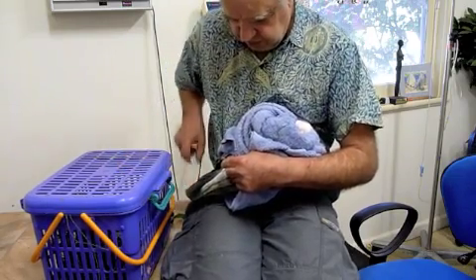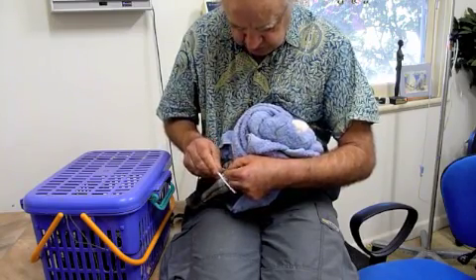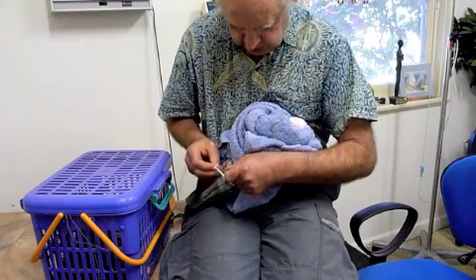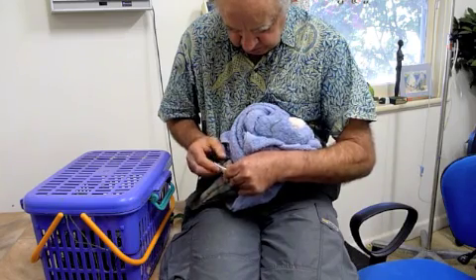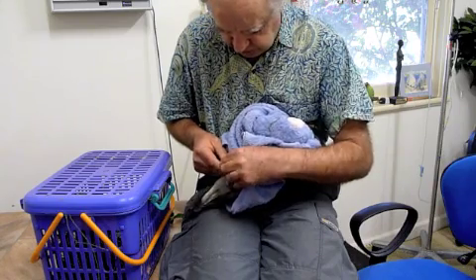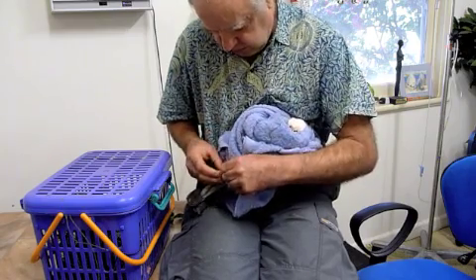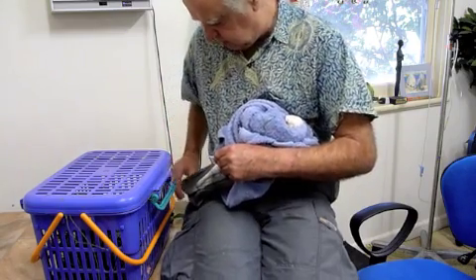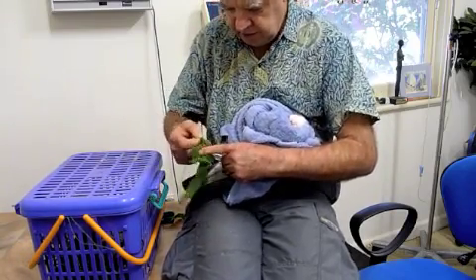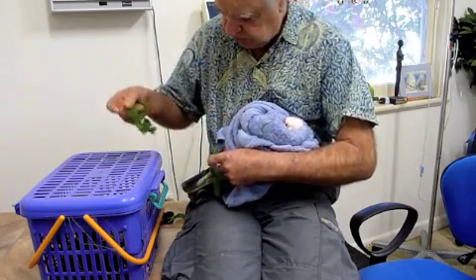The next step will be to see how this strip of vetlite fits, so I'm going to put one toe in there, one toe in there, one toe there, toe out the front, and just get that one in position, that one in position. Now the idea is to start taping these onto the splint.